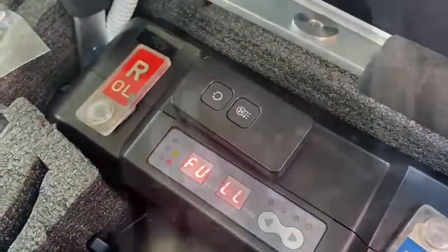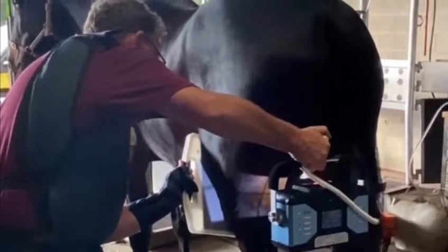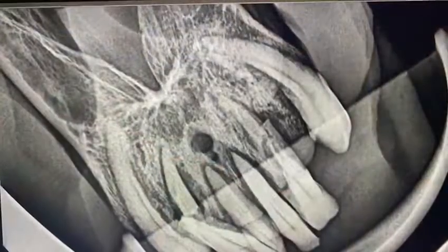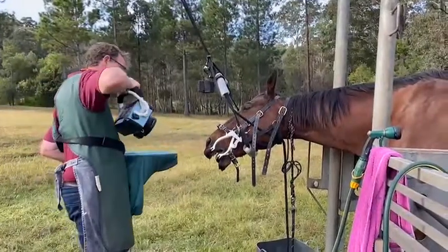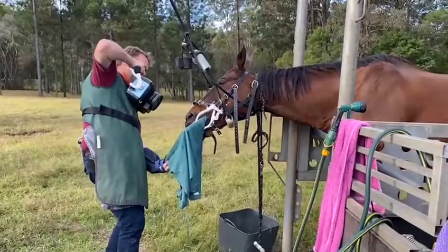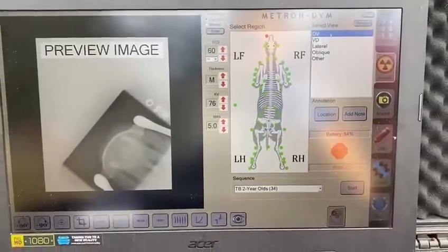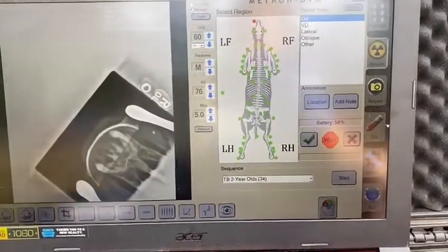It's telling you the battery's full there.